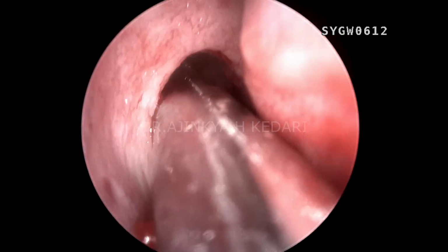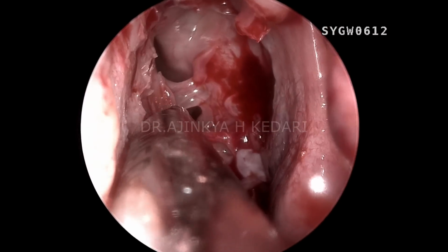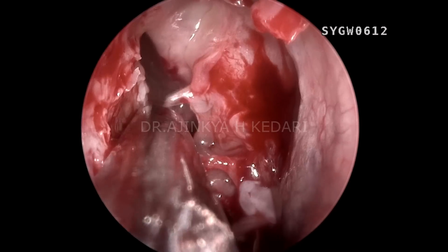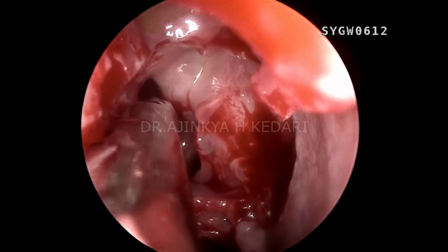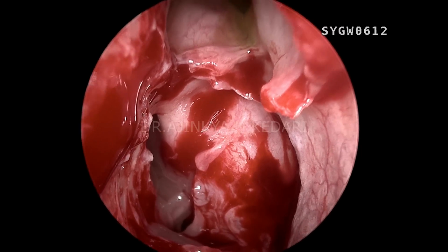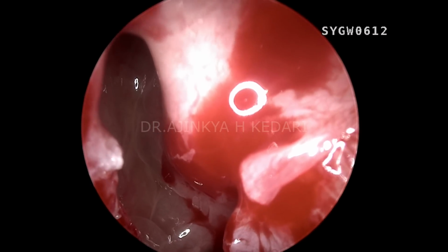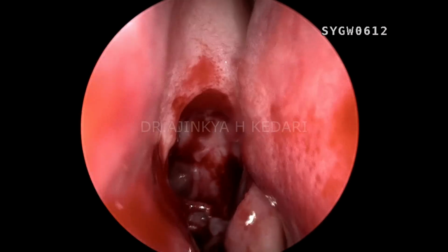Currently I'm removing the anterior ethmoids, which are flushed along the lamina papyracea superiorly. You can see in some time I'll be exposing the lamina papyracea completely in its entire length. You can see I'm almost at the posterior ethmoid level. I've taken off the ground lamella as well with the debrider. Now you can see the frontal recess up there very clearly. You can see the frontal lobe of the brain prominence in the frontal recess sinus area. That's the second site of leak, which we could see on the scan, which is towards the posterior ethmoids.